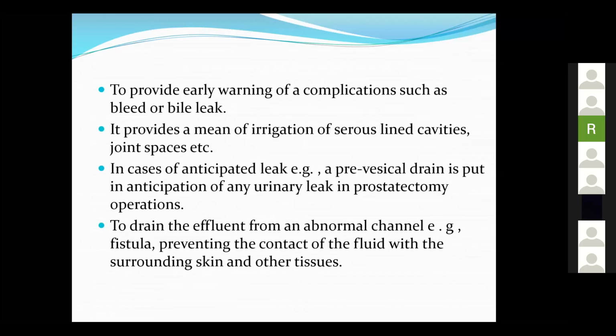And we want to use it where we are not too sure whether there is anything or not, so we put them in case there are any complications. Suppose we have done a cholecystectomy and secured everything, but maybe we think there was some oozing from the gallbladder bed, or you think the patient has severe empyema gallbladder and there might be an infection and collection, you want a drain so that you continue to see if there is any leakage, and you might be able to aspirate it.